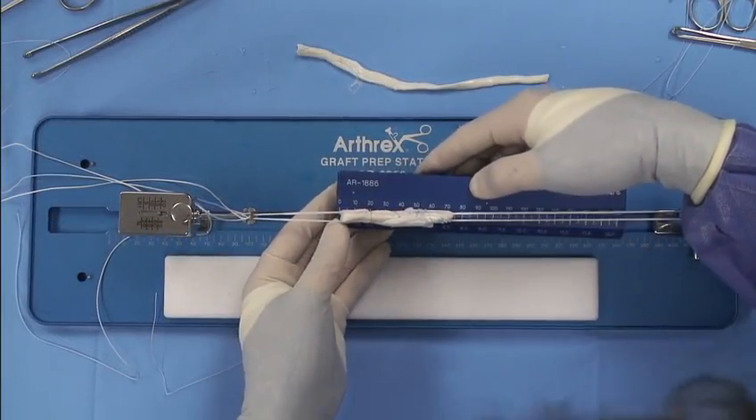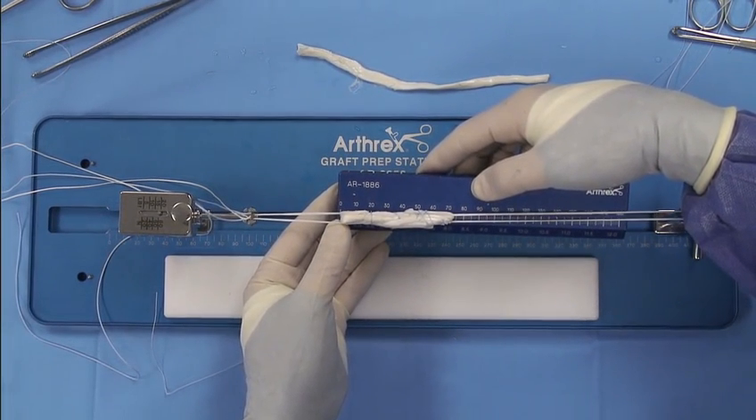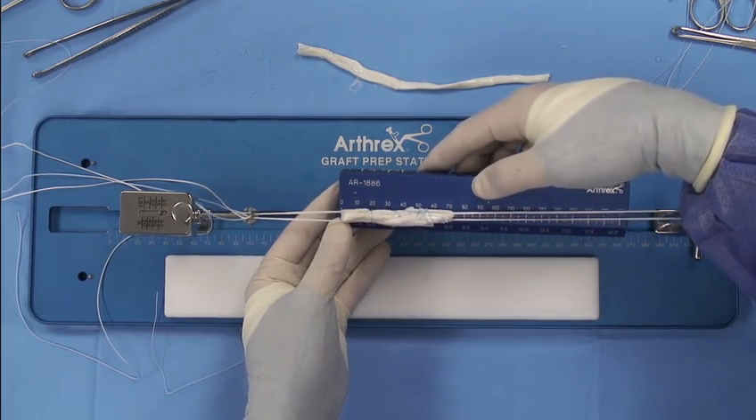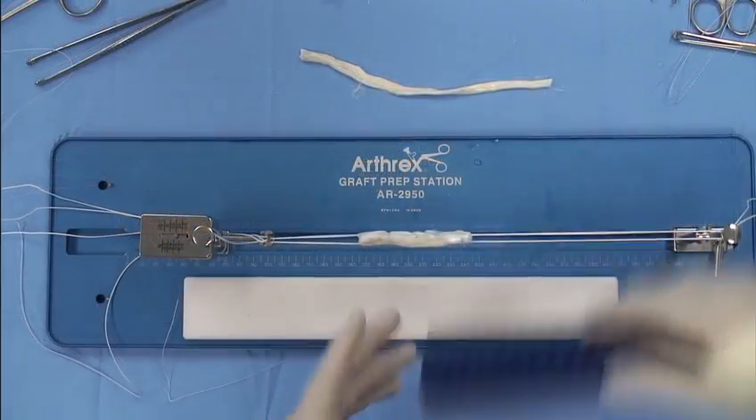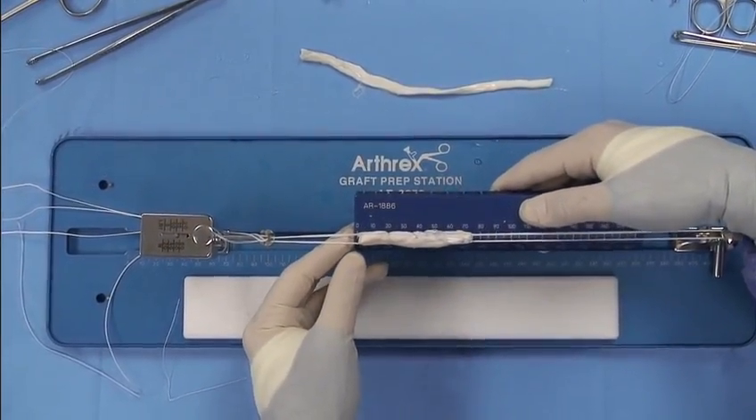As you can see here, graft length is 73, meeting our goal of less than 75 millimeters, which is optimal for all inside technique. So we'll use an eight, a nine by 73.